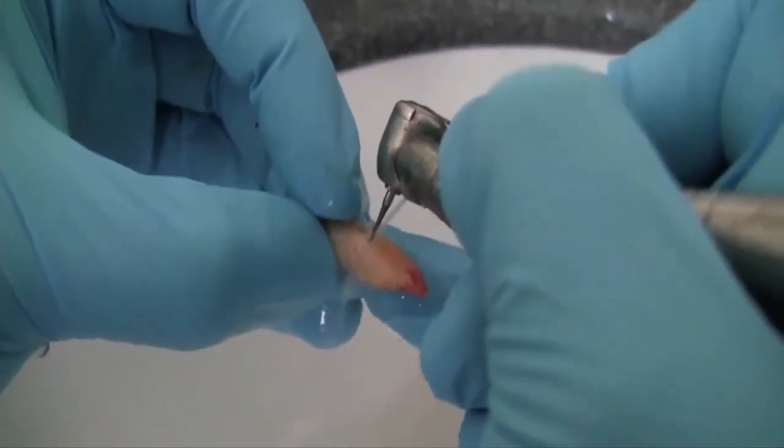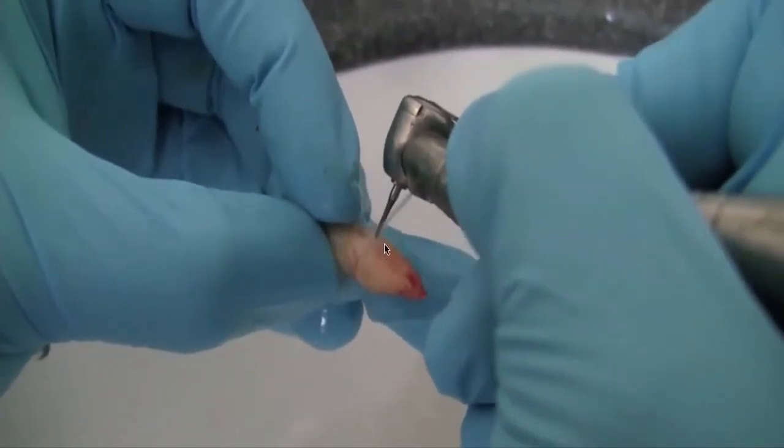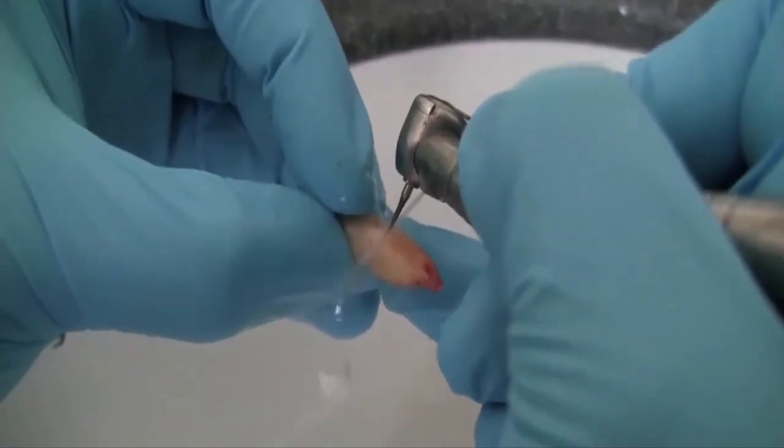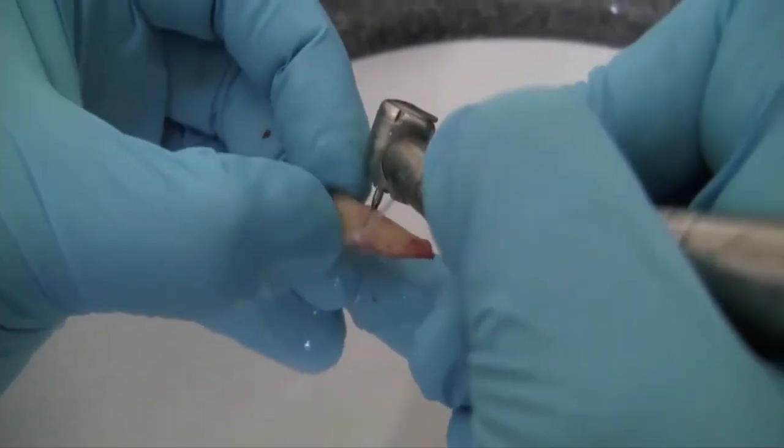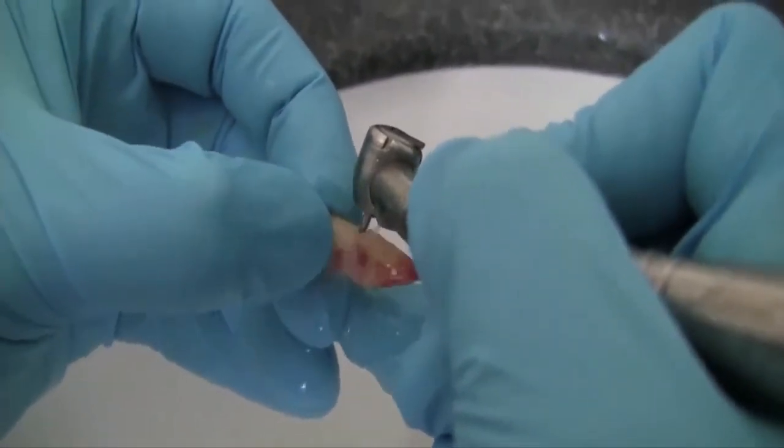Now we're utilizing a burr to remove the apical part of the tooth. We're removing the root and leaving the crown intact, because we're going to utilize that crown for loading purposes. It's going to be the temporary crown, trying to maximize cosmetics and minimize changes in the appearance of the patient.